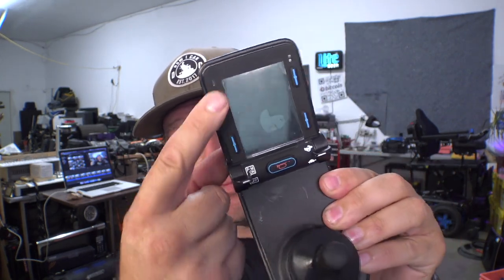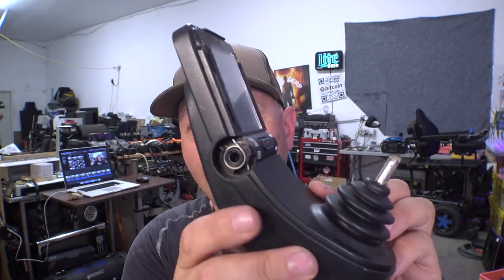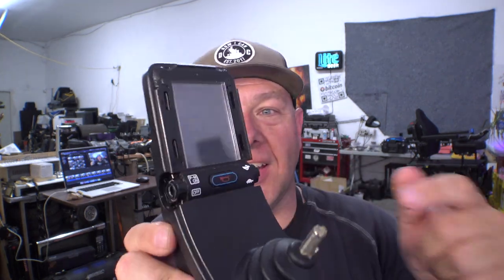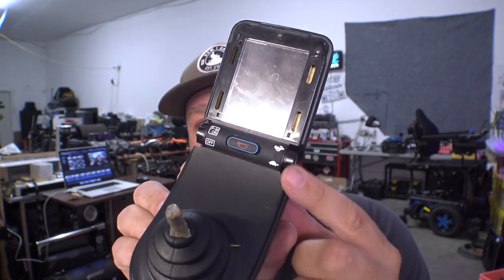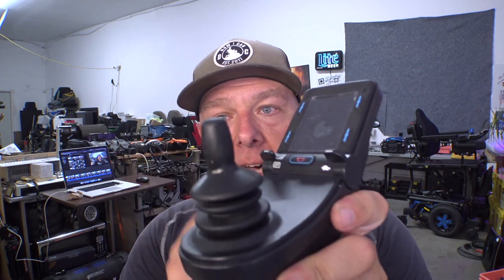Maybe it's not avoidable, and maybe they damage your chair. When they bring your chair back up after you've gotten off the plane, instead of having functioning buttons — the soft keys, speed adjustment, power on/off — the power toggle is completely missing, some buttons are gone, the speed paddles are gone. This is actually a real scenario. These things stick up and it's easy in the luggage bay of an airplane for baggage handlers to rip them off or break them. The same goes for older style joysticks.